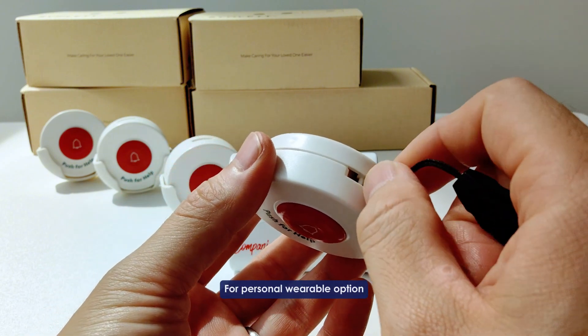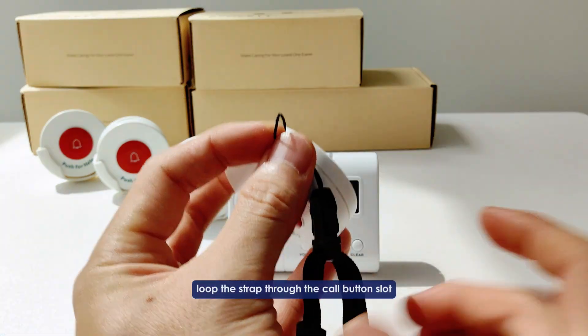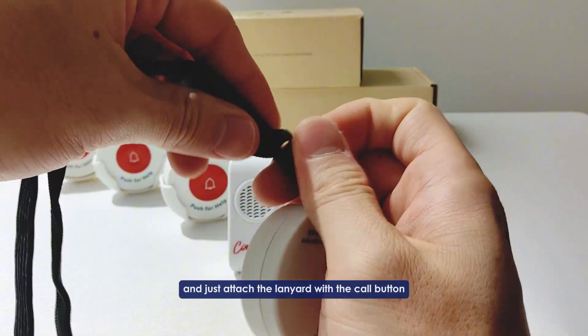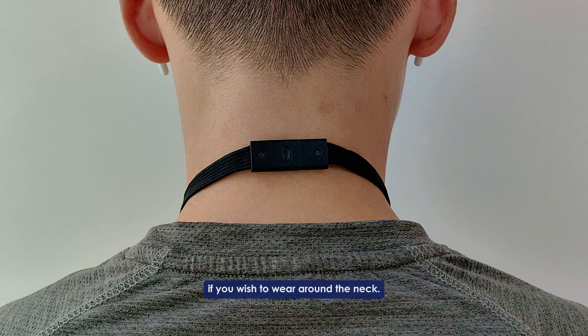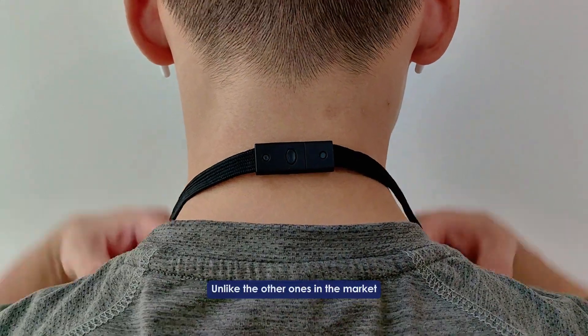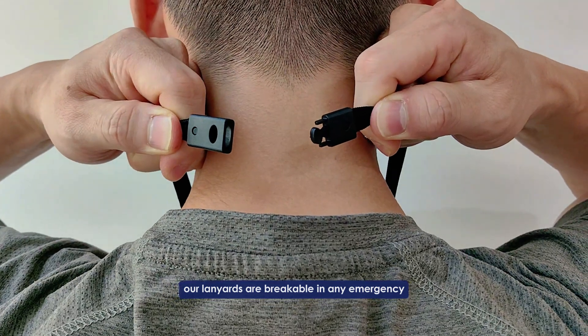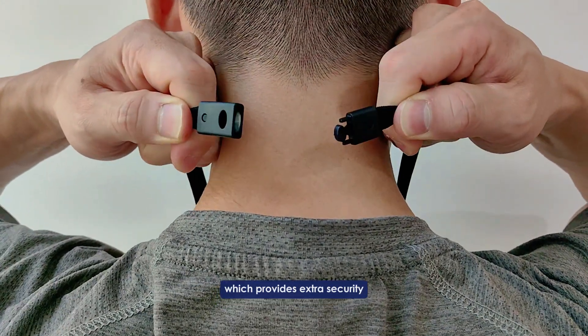For a personal wearable option, loop the strap through the call button slot and attach the lanyard with the call button if you wish to wear it around the neck. Unlike other ones in the market, our lanyards are breakable in any emergency, which provides extra security and safety for your loved one.